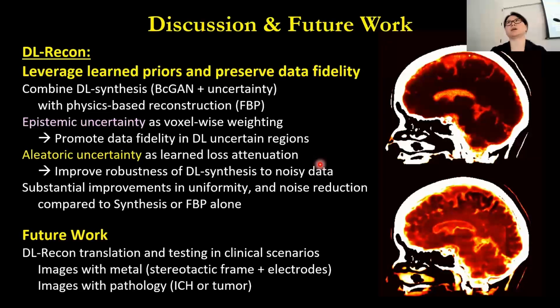It highlights the regions where there are two signals and you try to distinguish between them. I think the ventricle contrast and the brain parenchyma surface is one of those signal separations. So that's why aleatoric uncertainty is also high.